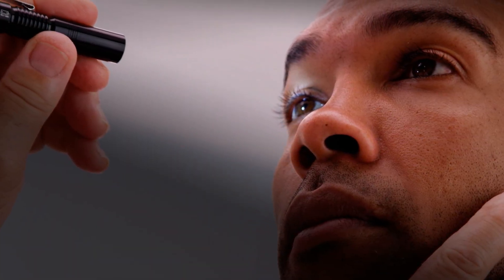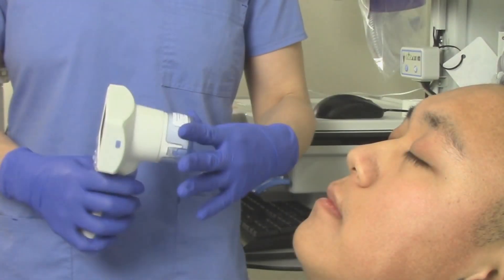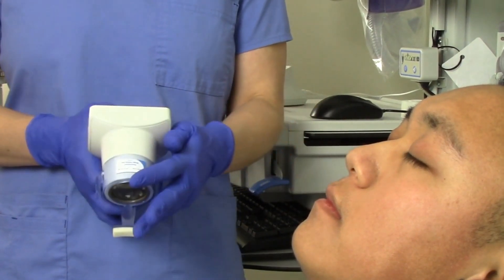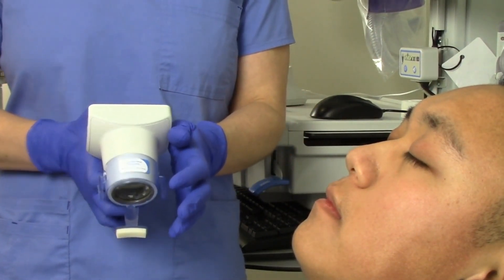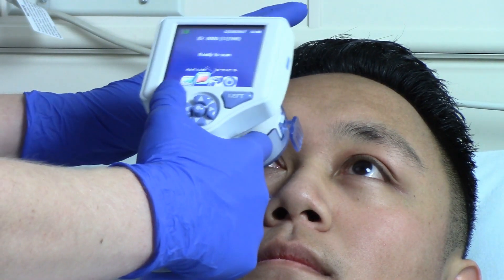Pupil examination is an essential part of the neurologic exam. Manual pupil measurements are subjective and prone to error and inter-examiner variability. The pupilometer is a simple to use handheld device that provides accurate, reliable, and objective pupil size and reactivity data independent of examiner.